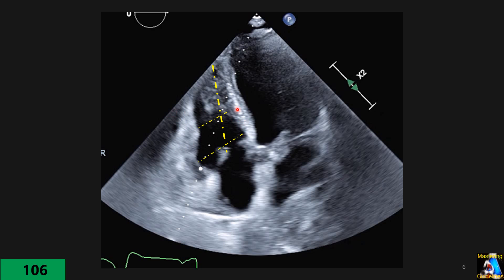Not horizontally to the picture — parallel to the tricuspid annulus. The mid measurement is taken almost at the mid-RV, usually below the papillary muscle, parallel to the first line. For the length, review the loop back and forth to find the connection of the RV apex to the septum, then measure from that tip to the center of the tricuspid annulus — not the baseline, the annulus line. This is how you measure RV dimensions.